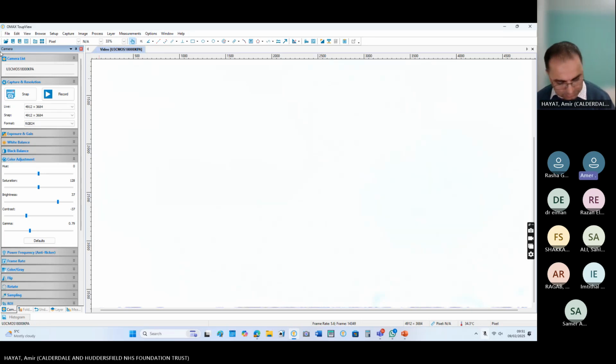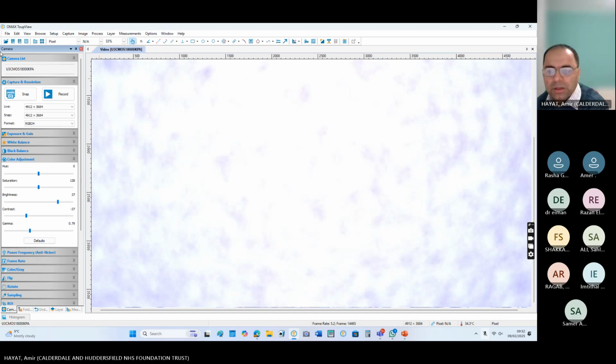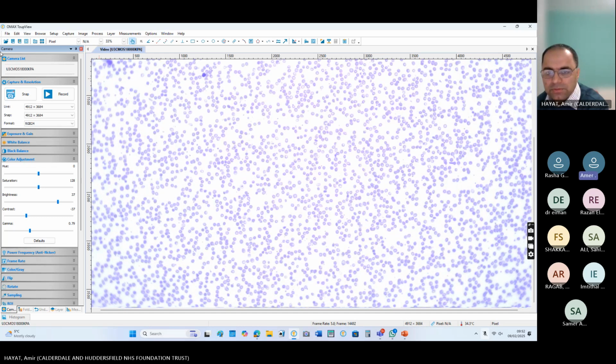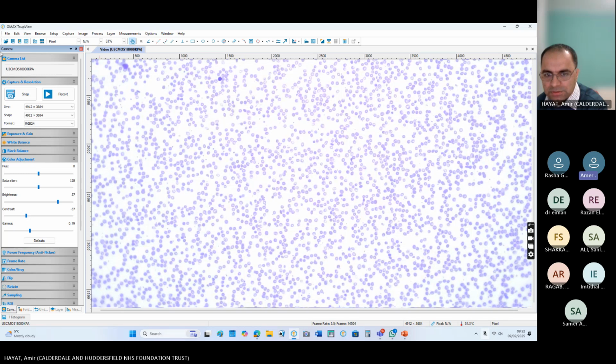This is again a 19-year-old young patient who had a motorcycle accident 3 years ago and had abdominal surgery. So this film is not for diagnostic purposes. This film is just for the features. What abnormal features do you see in this blood film?